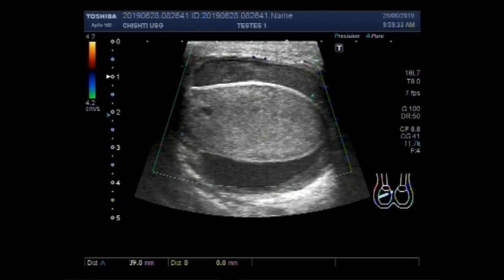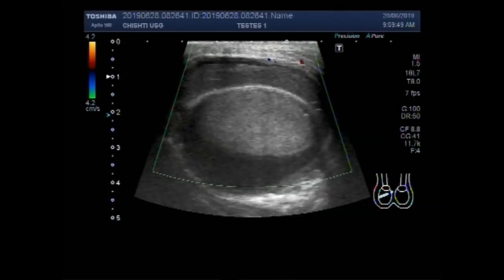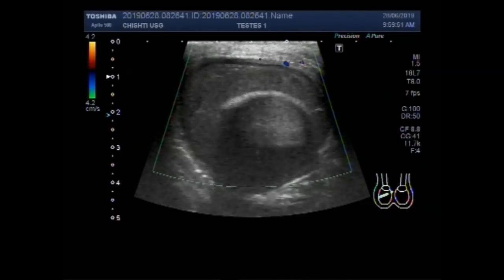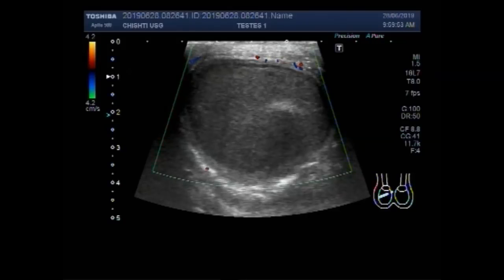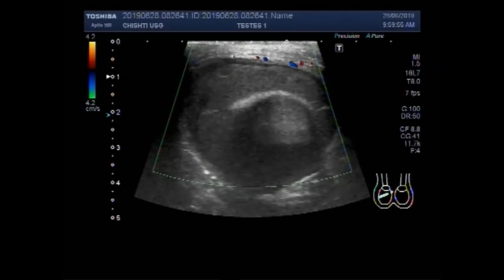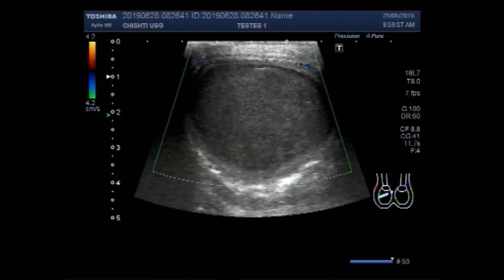Now this is the measurement of the testes — it measures about 3.9 cm by 2.7 cm — and you can see a very thick fluid collection seen in the scrotal sac. This is a large pyocele.